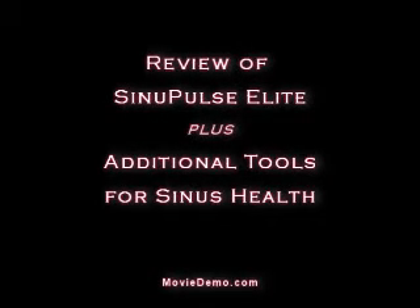Welcome to Moviedemo.com's review of the Sinu Pulse Elite from Health Solutions. Also in this video, we're going to talk about additional tools for you to maintain your sinus health.